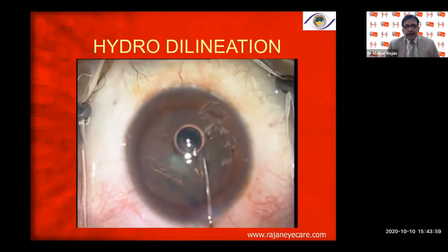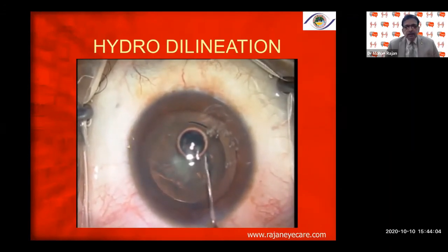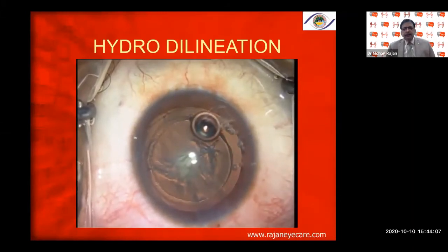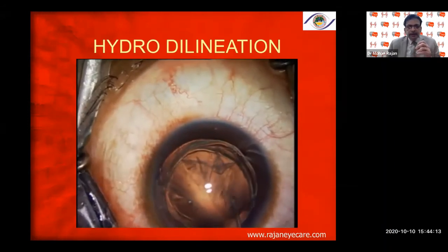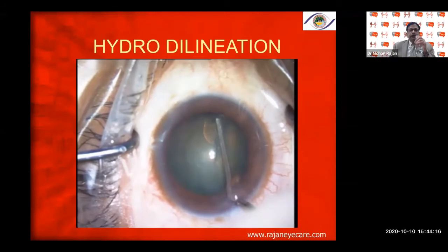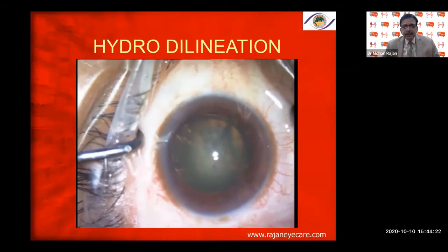In another patient with hydrodelineation: whereas in hydrodissection I go underneath the capsulorhexis, here I go into the center — at the junction — where you can see the golden ring of hydrodelineation, which is very visible. You can see the separation of the endonucleus from the epinucleus. I do not do hydrodissection as a routine — hydrodelineation only for traumatic cataract, cataract post-vitrectomy, posterior polar cataract, and patients with multiple anti-VEGF injections.